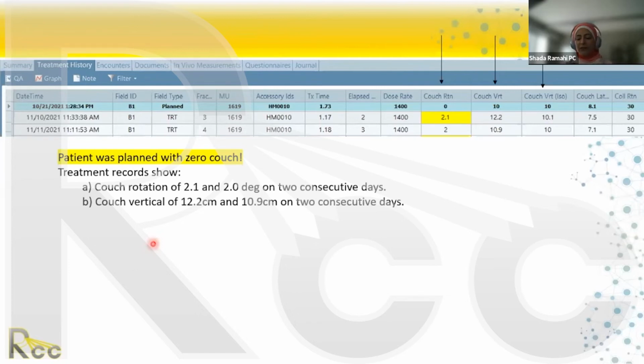Well, radiation oncologists, we're okay with that, because the thinking is, as long as I am aligning the tumor, who cares what happens in everything else. If I need to do 5 degree rotation or 7 degree rotation or pitch or roll, what's the problem? And the physicists were pulling, no, we cannot do that. We have to put a limitation. We're going to tell you why we need to put a limitation before we go inside and reposition the patient. I'm going to show you in a minute with a schematic diagram.